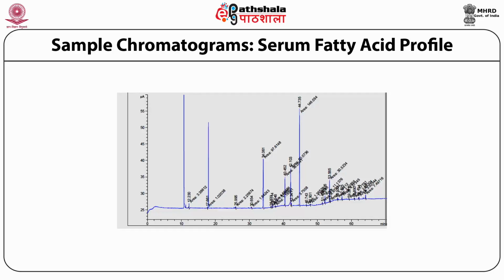rise in the baseline towards the end of the chromatographic run. So that is not ideal. However, this is the range that you typically observe when you're analyzing serum. This particular sample, actually, the serum has been eluted out of a spot of blood from filter paper, and then that has been analyzed, indicating to you the sensitivity with which this process can detect the different analytes.